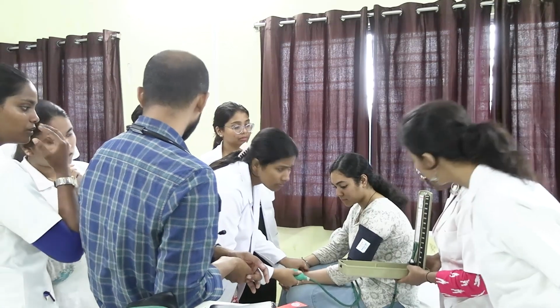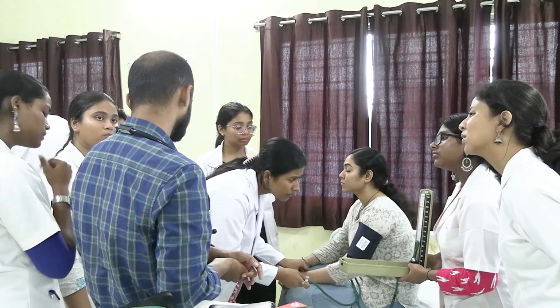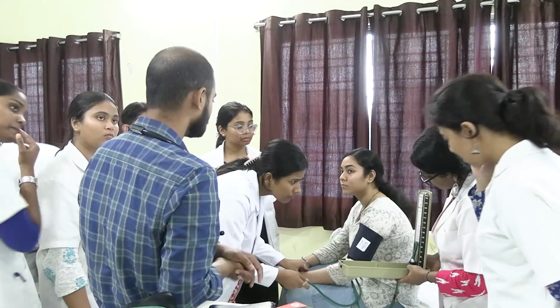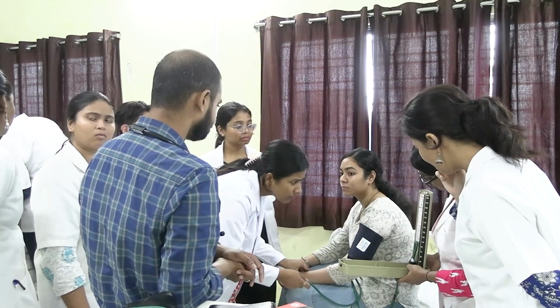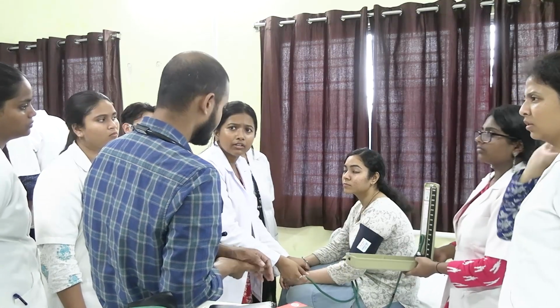So when deflating, you will be feeling the pulse, and the reading is also there. The pulse will guide you. Sir, around 90. Okay, fine.